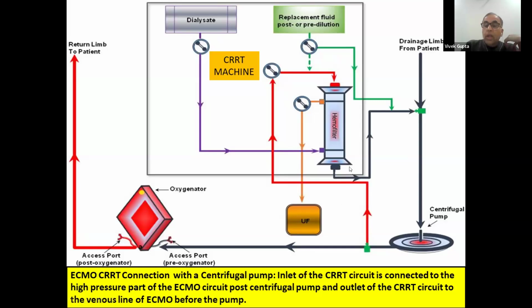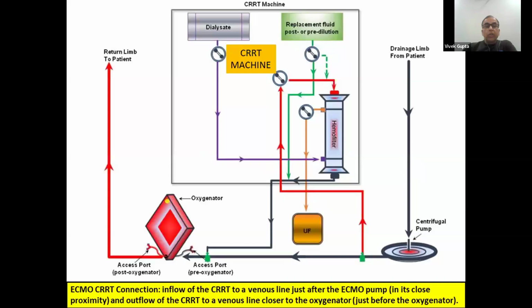The only disadvantage of this method is there can be recirculation of the dialyzed blood.